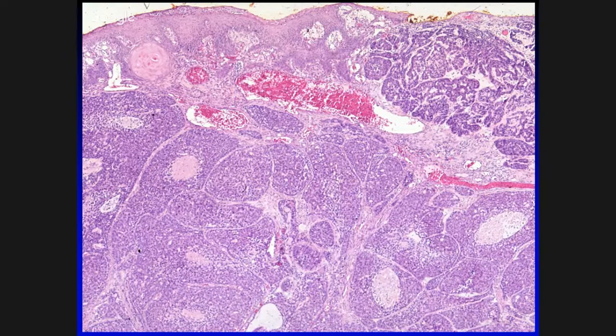So here's an example. There's a little bit of abrupt keratinization, so this is not normal. That could be construed as the squamous component, but you could see this deeply invasive basaloid proliferation in which the nests fit into each other like a jigsaw puzzle. Hence the terminology jigsaw puzzle-like architecture. It's lobular, with or without comedo-type necrosis.